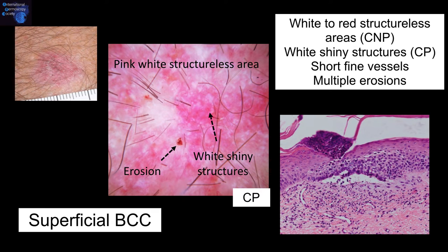Another example, in this instance with contact polarization. In the contact polarized mode, we see pink-white structureless areas, erosion, and white shiny structures.